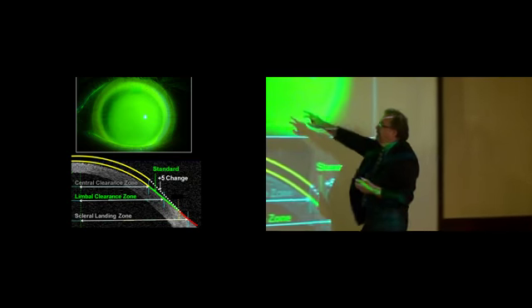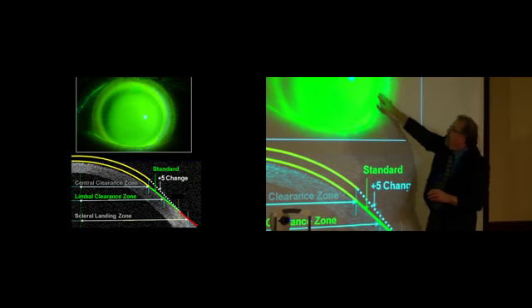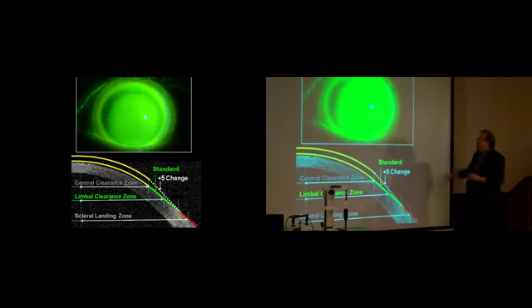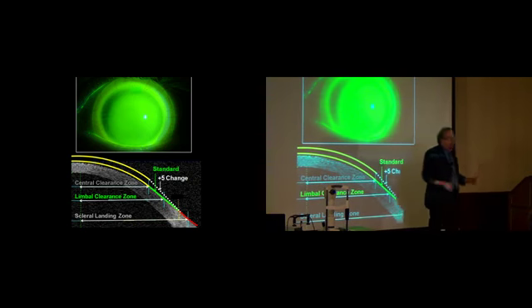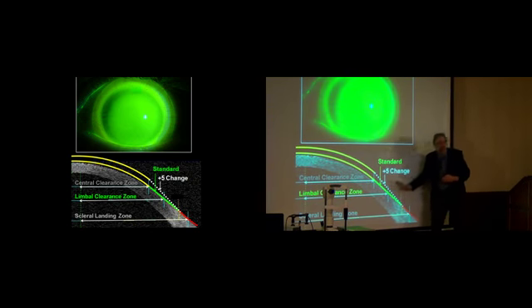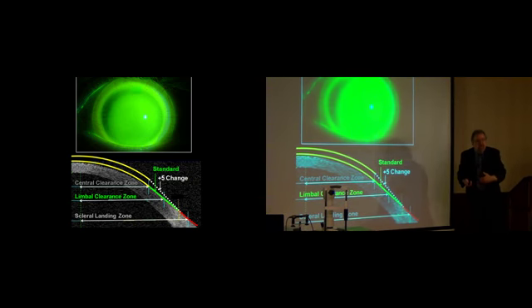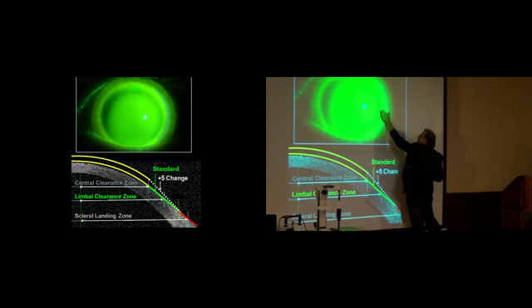Now, here is a patient that would benefit from that 5-degree change. You'll notice here that on the nasal side, we seem to have fluorescein thinning. I'm not going to panic there, but I'm following that thinning up, and I'm seeing it's going all the way around and even somewhat visible on that temporal side. So when I see that area of touch covering an area of greater than 180 degrees, that's when I begin to entertain the idea that I'm going to want to change that peripheral angle 5 degrees and simply open up the periphery a little bit more.